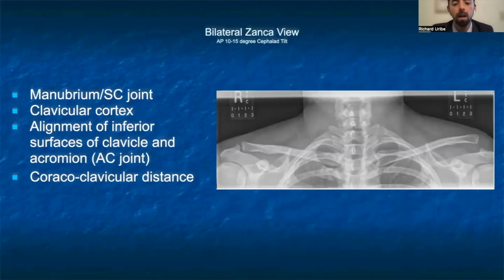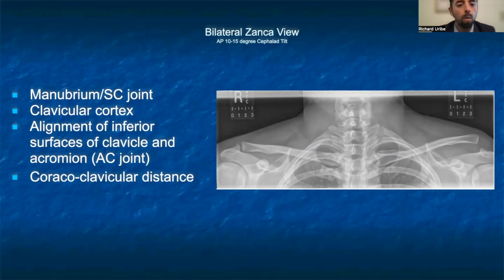The second common view we will discuss is the bilateral Zanca view, which is an anterior-posterior projection with a 10 to 15 degree cephalic tilt, best at assessing the acromioclavicular joint. One additional important landmark to note is the coracoclavicular distance, which helps us understand the integrity of the coracoclavicular ligament. A normal value is between 1.1 and 1.3 centimeters.